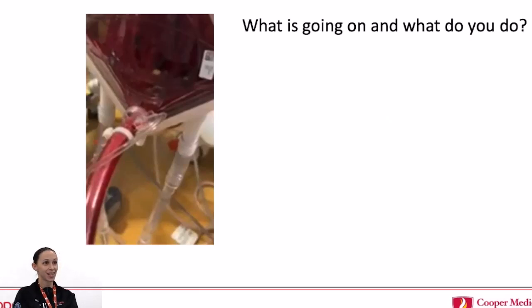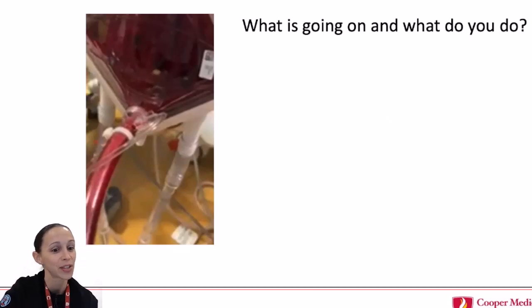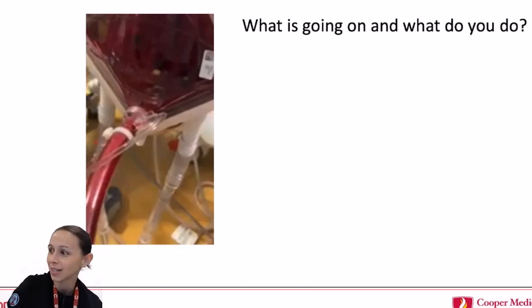Circuit change. Yeah, so call for help. Reiterate that. Clamp off the circuit. In this scenario, I forget if we did this because that's a blur, but did we try to go on hand crank? Because there is actually a backup pump, which technically, if you disengage one pump, you're still with the same pump head, so I guess that wouldn't work. Yeah, you still have the clot.